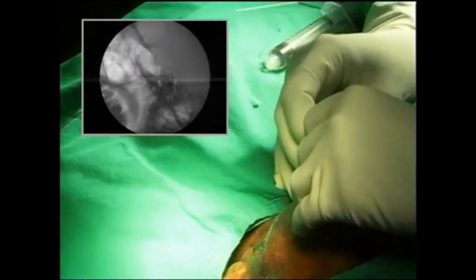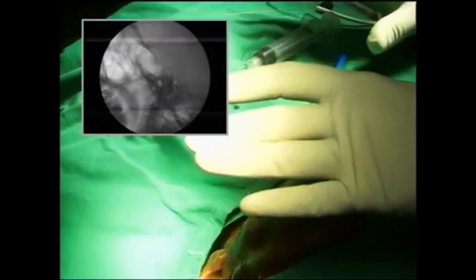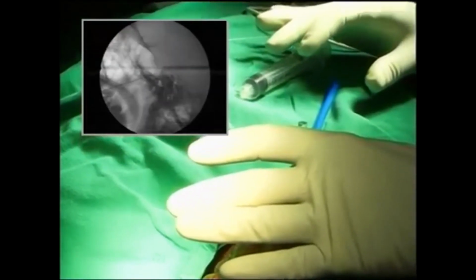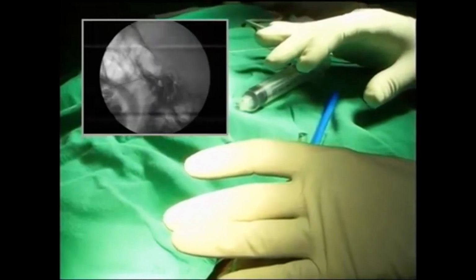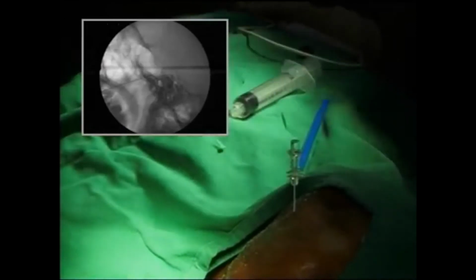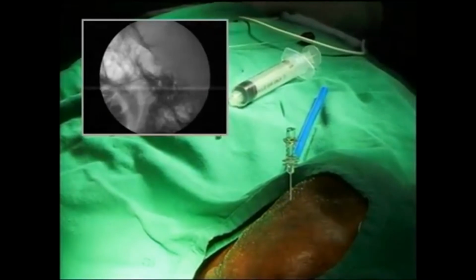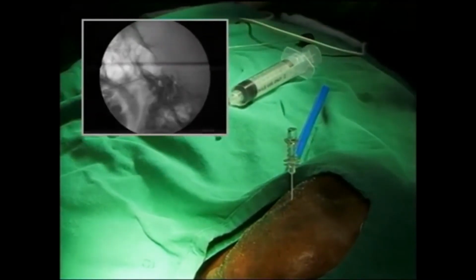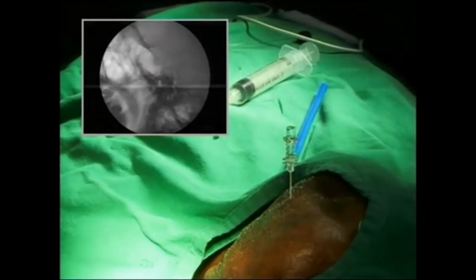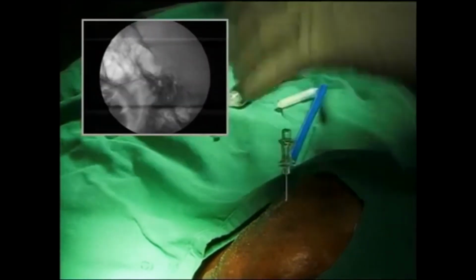Relax. Okay, I'm going to take a 2cc syringe and then do a negative aspiration. Give me a 2cc syringe. And then I'll stimulate again and then do it. Let me do a stimulation and then we'll do the thing.